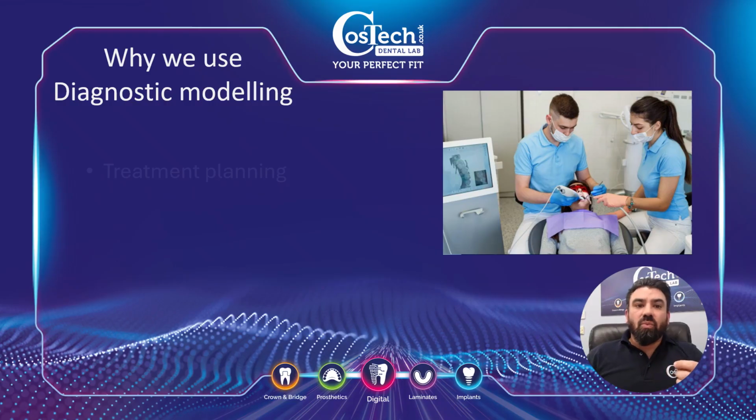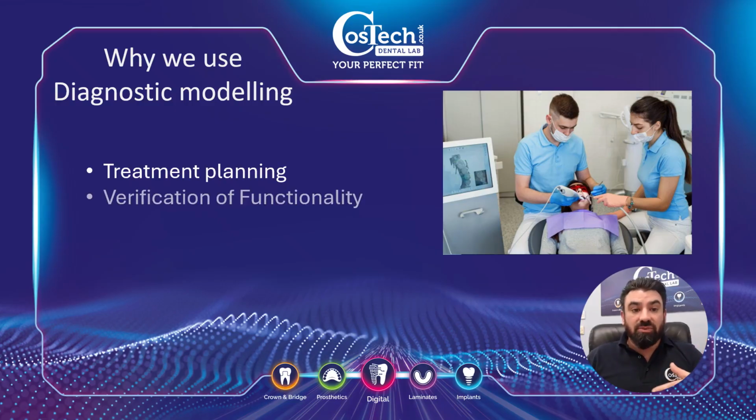So why do we use diagnostic modeling? It's essentially for treatment planning. So we can actually bring together yourself, the dentist, with the patient and the technician. It becomes a universal tool, basically one hymn book that we're all singing from.